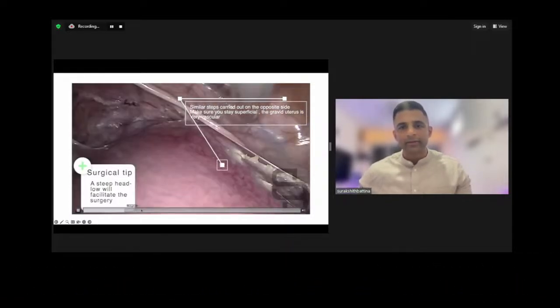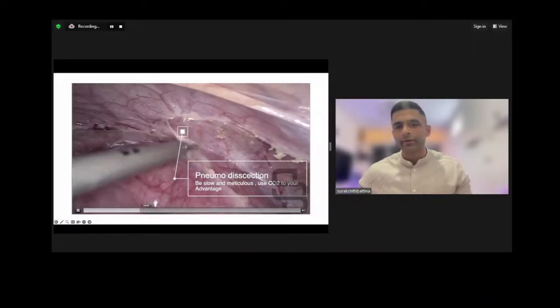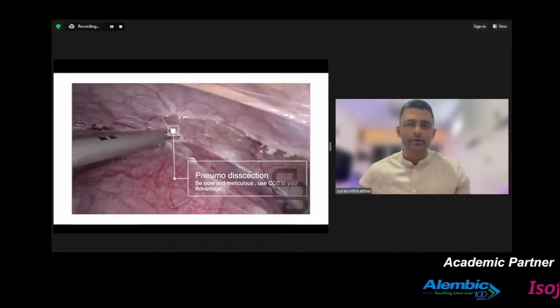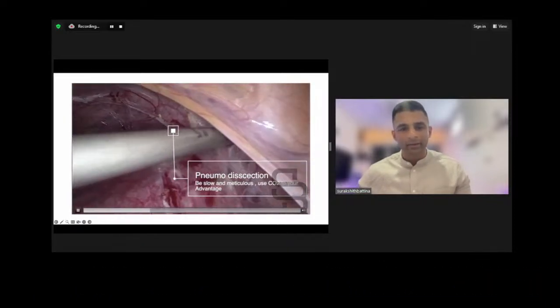As you can see here, we are going again millimeter by millimeter, just pushing the bladder down. Use the pneumoperitoneum to your advantage. In all the other procedures, we try to be a little bit quicker, but here we have to make sure that we're going slow and step by step, because if you go a little bit faster here, you might end up having a lot of bleeding.